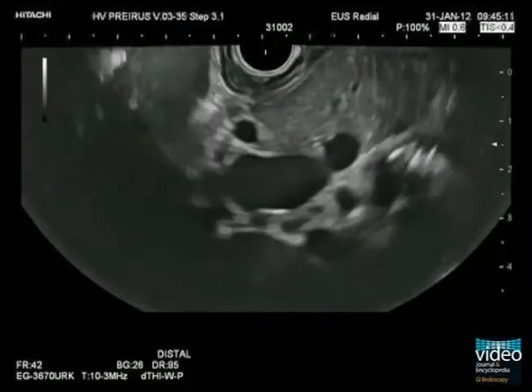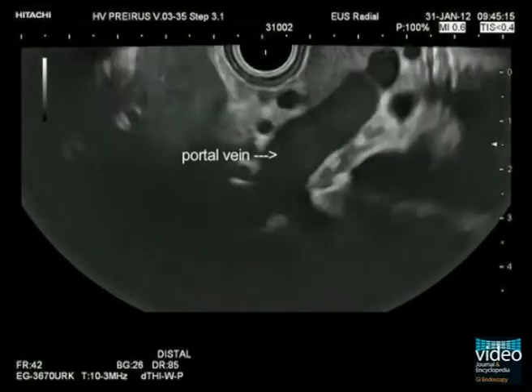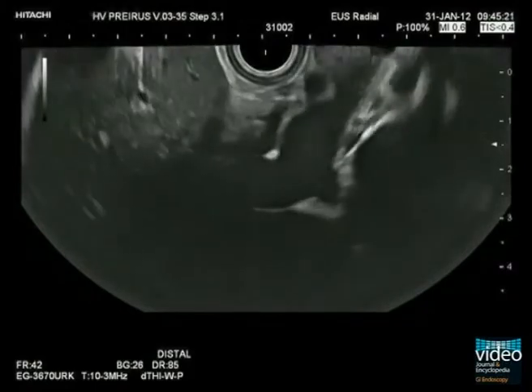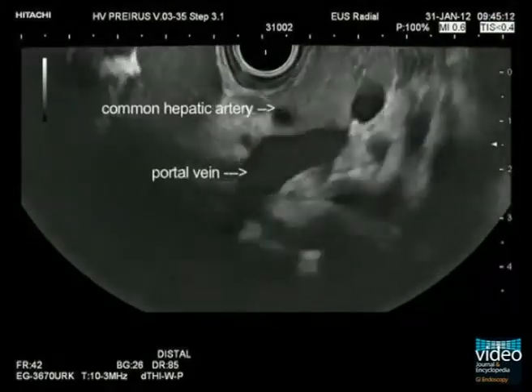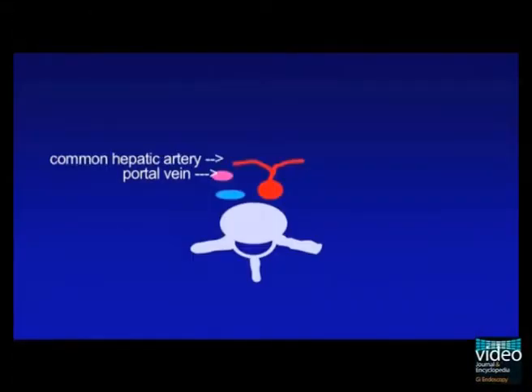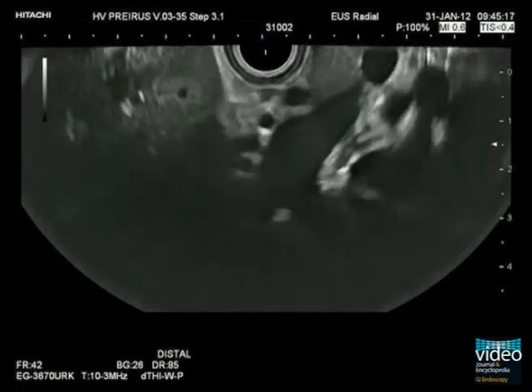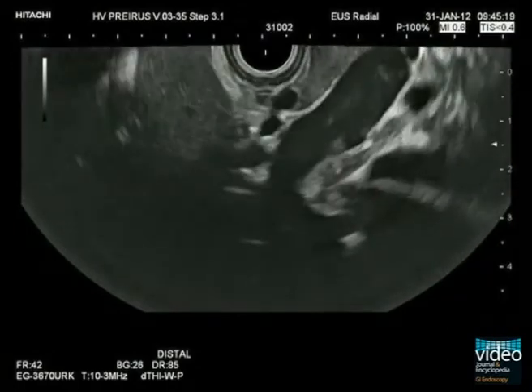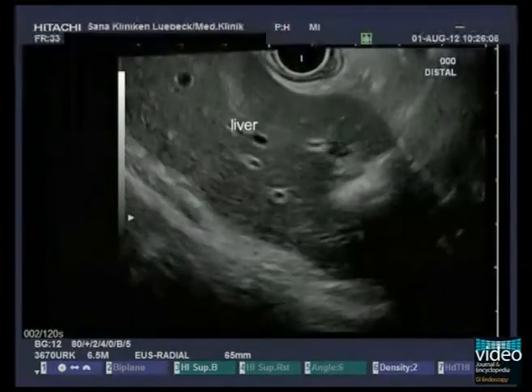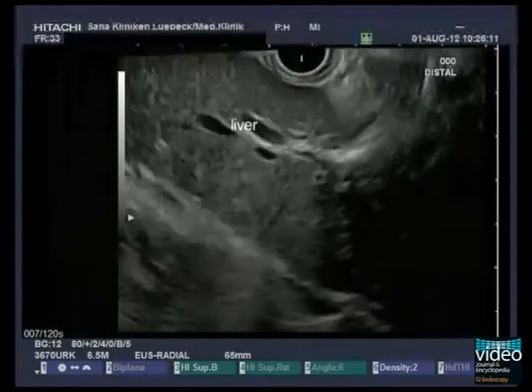To follow the portal vein, the endoscope should be turned further to the left and pulled back. Now follow the portal vein to the portal bifurcation. Close to the transducer is the common hepatic artery, which accompanies the common bile duct and the portal vein. Together with the hilum, large parts of the liver are visible and should always be included in the examination.